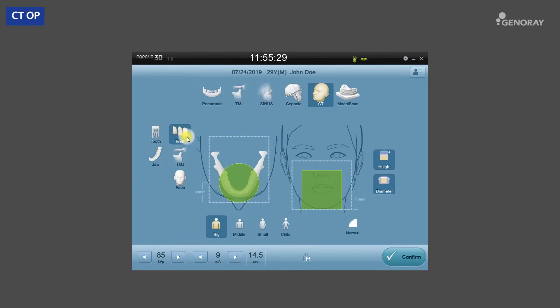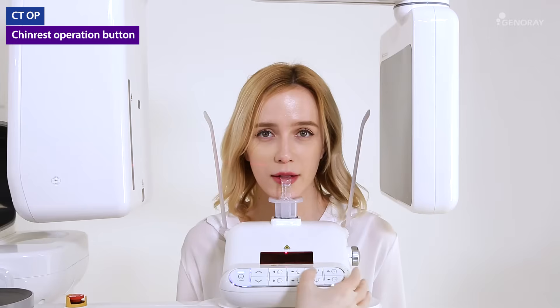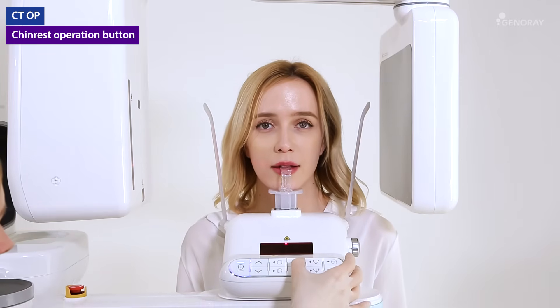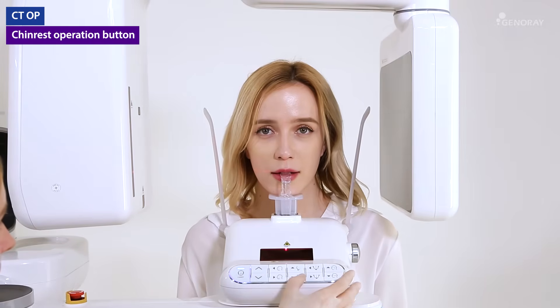Next is the CT mode. CT mode allows you to scan multi-size FOV depending on your need. After selecting the desired exposure mode, click and position the green box in the desired scanning area and follow the instructions on the next page. Confirm that the laser positioning is correct according to the instructions on the screen. If necessary, use the chin rest operation buttons to adjust the correct position.